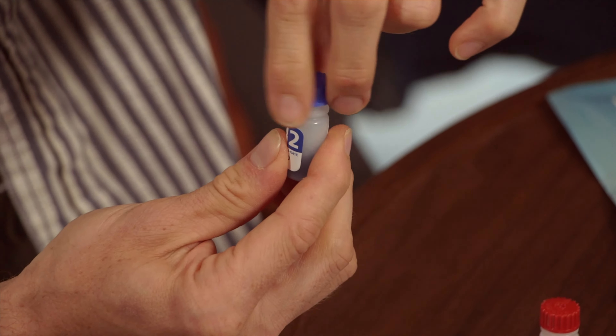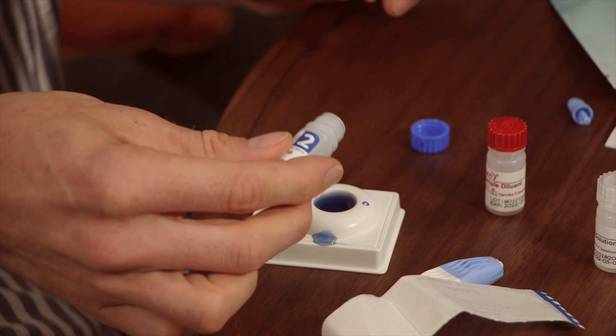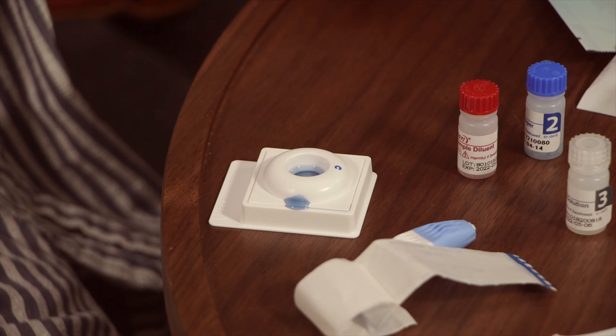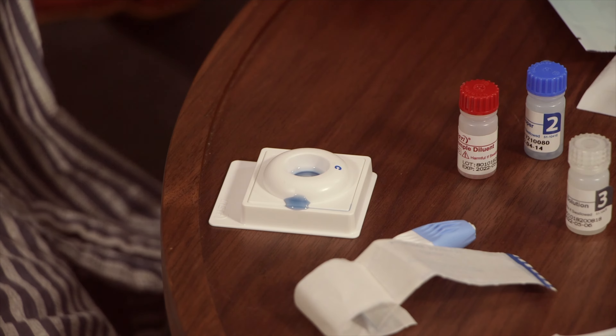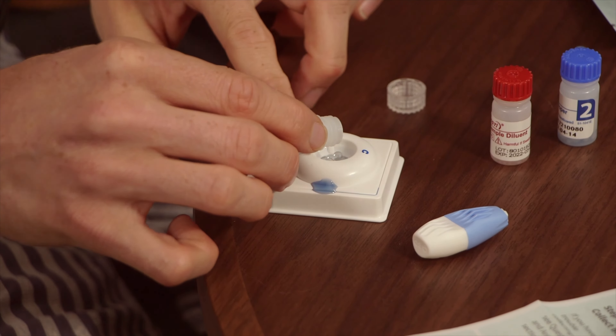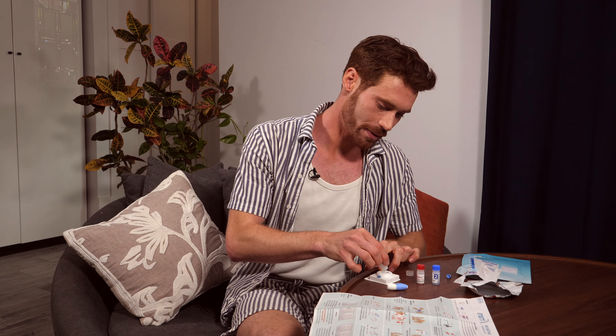Now bottle two. Pour the liquid into the tray. We lost a little — it's okay if you lose a little, just keep going with the test. Wait for the liquid to absorb again. Grab bottle number three, pour the liquid in carefully if you can, and again wait for the liquid to absorb.